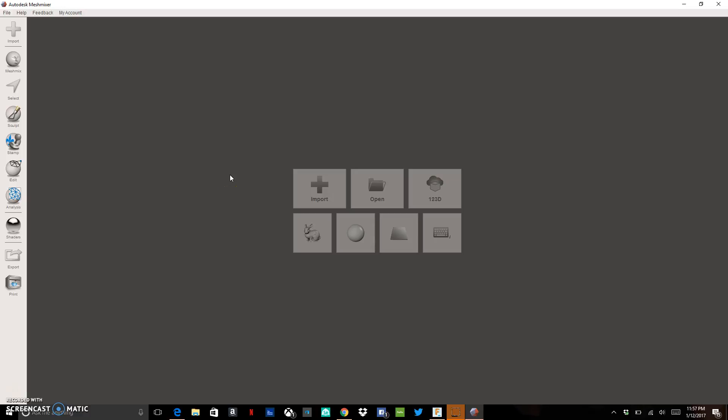So we've used our structure sensor from Occipital to get a scan of a residual limb. Now we need to adjust that scan a little bit so that we can make it usable by Fusion 360.